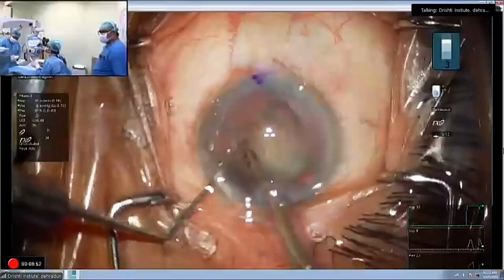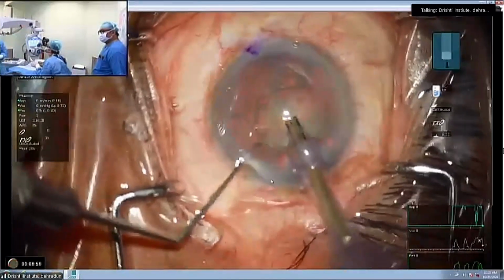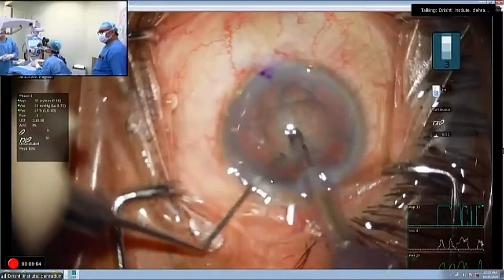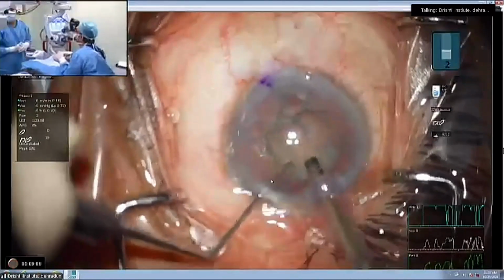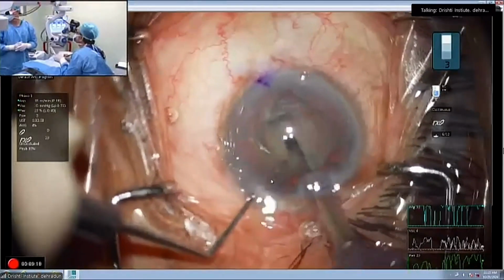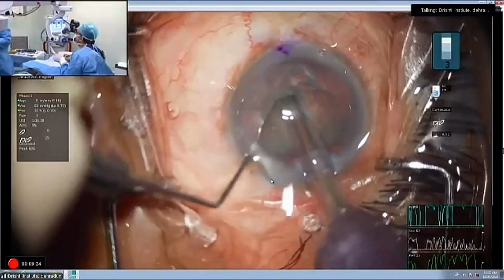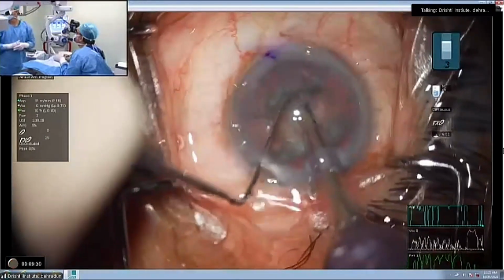Yes, of course, people do have a perception. I keep talking to surgeons, they generally have such inhibitions at times that maybe the monofocal plus may also have comparatively lower quality of distance vision. But in my experience, I would say most of them are absolutely fine. Of course, it is not a myth that these lenses do have a bit of difference, maybe in some eyes where the patient may not be crisp 6 by 6 at times, but mostly these patients are as good as with the monofocal lenses.